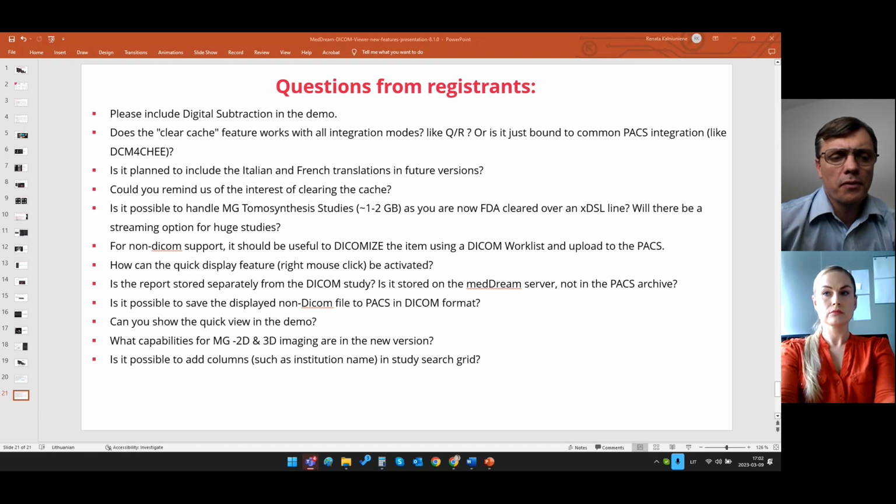In this case, that's why non-DICOM visualization is needed. Like in a VNA, we have some documents which we prefer to keep in the original format for interoperability, but systems could utilize them for different needs. For that reason, we created a specific non-DICOM interface, because we know all users already supported PDF, PNG, and all these formats in the previous, DICOMized way.